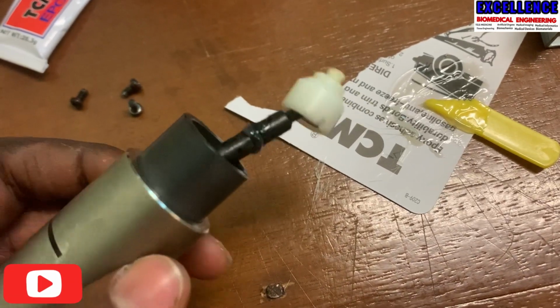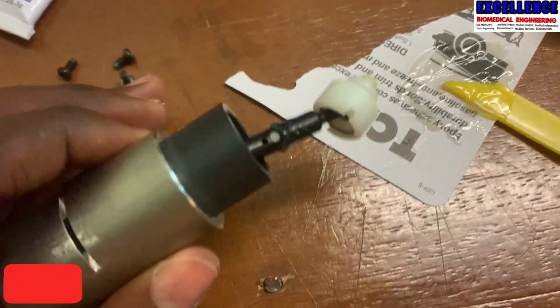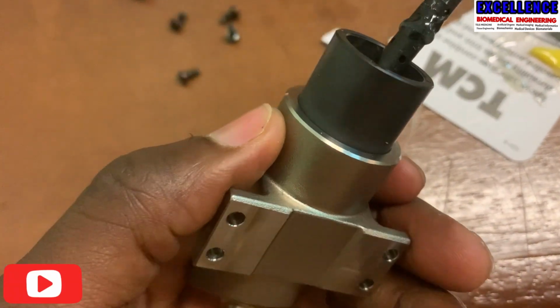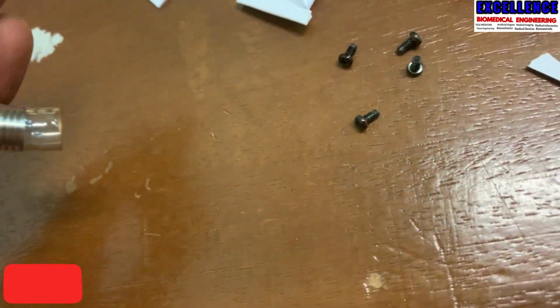All right, so we are good to go. I have just applied this adhesive to this piston. So let's watch out after it gets dried for 4 minutes, as it is being called.